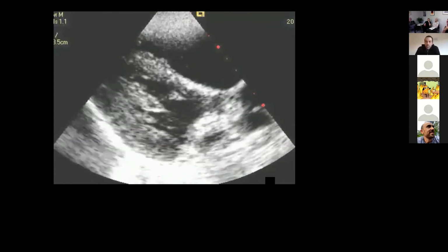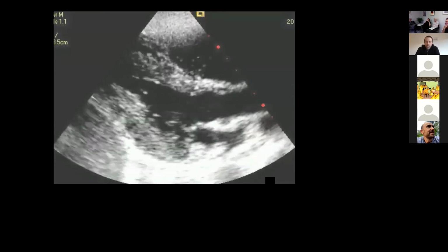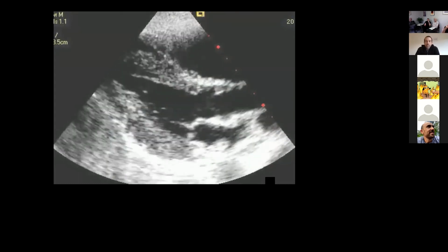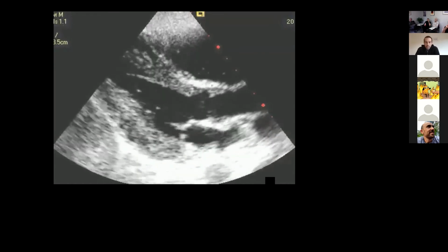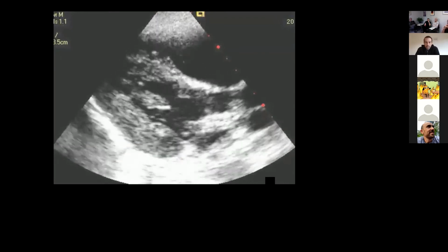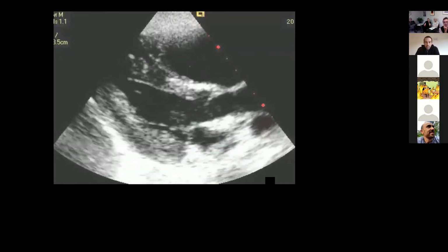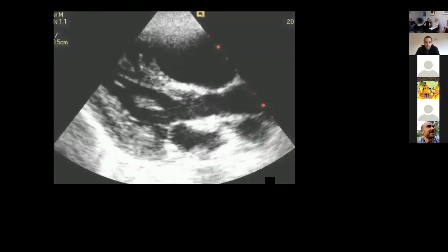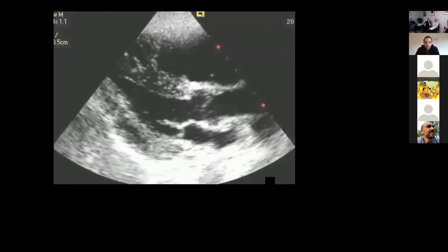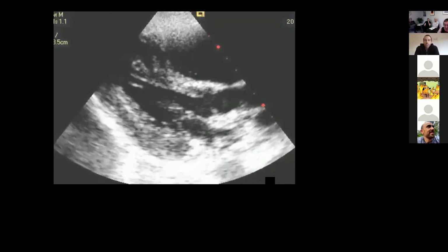So this quick view shows a large right ventricular outflow tract and the septal bounce to the left side, denoting pressure overload from the right ventricle. Likely in this context, it could be either an amniotic fluid embolism or a pulmonary embolism. And lots of bubbles. And the other thing to note there also, look at the left atrium. Small as can be, mitral valve hardly opening, and this is the classical situation where you have some obstruction, and you see it with pulmonary embolus of some sort.